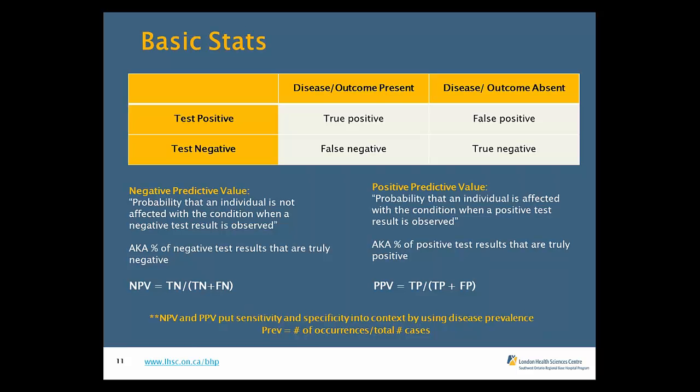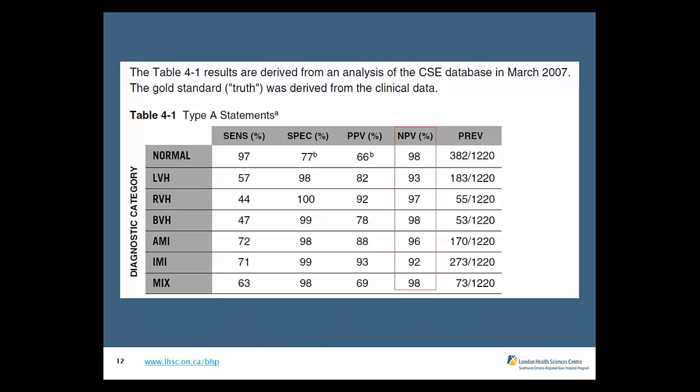So oftentimes when you get an ECG that doesn't say acute MI suspected or ST elevation myocardial infarction, the way these algorithms are set up, it's very unlikely that it is actually a STEMI. So it's going to miss very few STEMIs. But again, the trade-off is it will probably overcall things more than it should. And that's the safe thing for a test, to tend to overcall. And that's where your interpretation comes in.